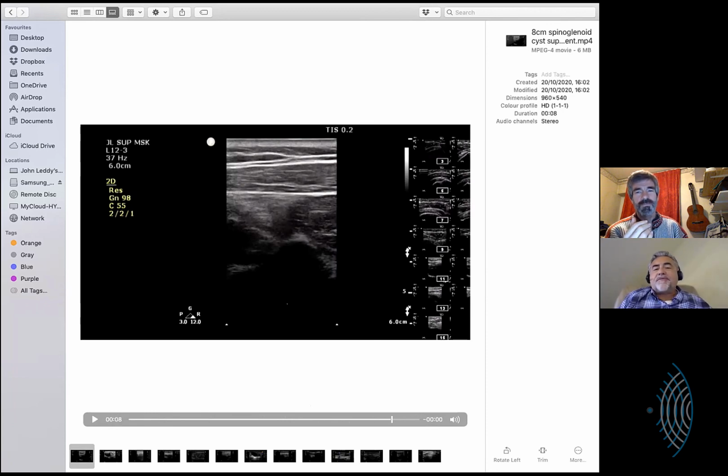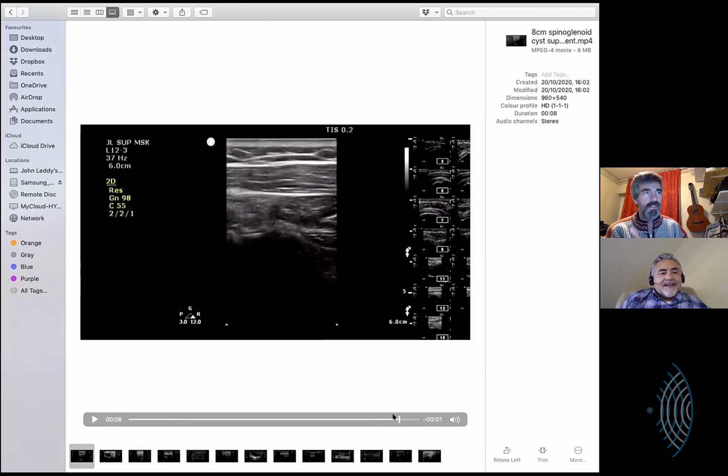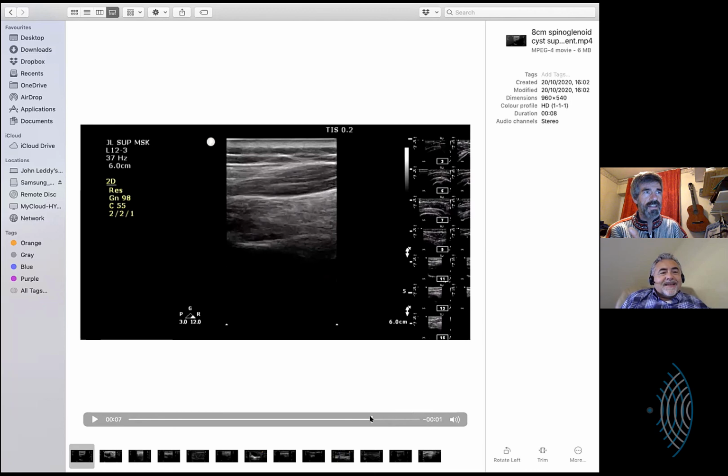Yes, it's hypertrophied to at least assist in external rotation. Oh, no? No, that's normal muscle texture. This is not normal muscle. So that's fibrotic. Now this is suprascapular nerve impingement, presumably secondary to the thing, but that's the texture. And hopefully, if I wind back through slowly for you, goodness, and this is why we do it. There, do you see that texture? Yes. Absence of muscle texture, yes.